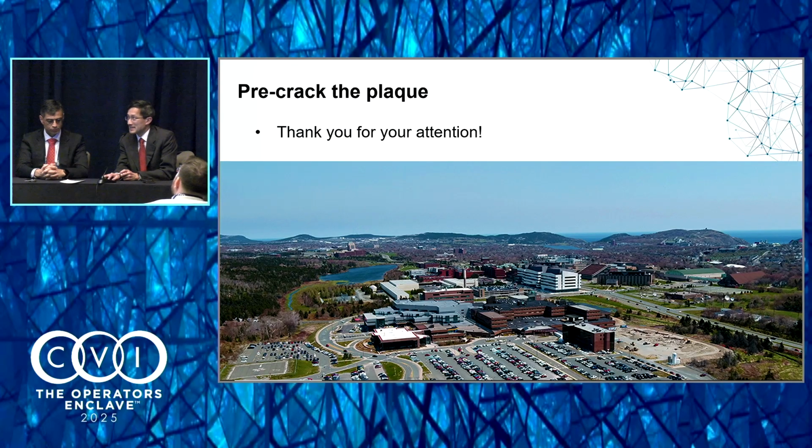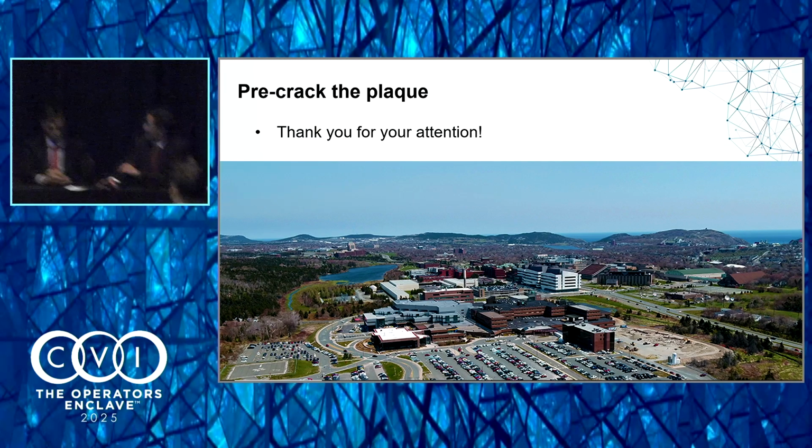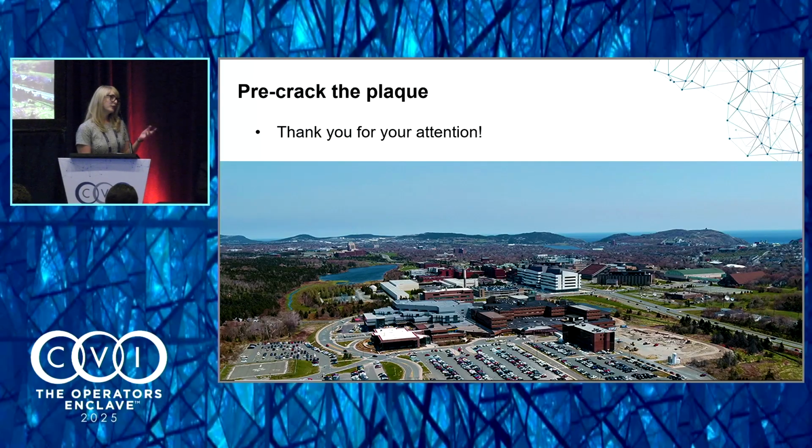Thank you, Allison. Just to highlight the cost effectiveness, the OPN balloon is listed as $1,200, whereas your Shockwave is $4,500 and your Rota is about $3,800. Question for you, on the case that you showed where you had to go distally, were you able to use the same balloon multiple times, or did you pull out a new one? I did actually. For the OPN, I did use the same 1.5, but it's a good point. Sometimes when you've already inflated a balloon, whether it's an NC or an OPN, it can be more difficult to deliver it that second time, so you would just have to take a new device if that's the case.